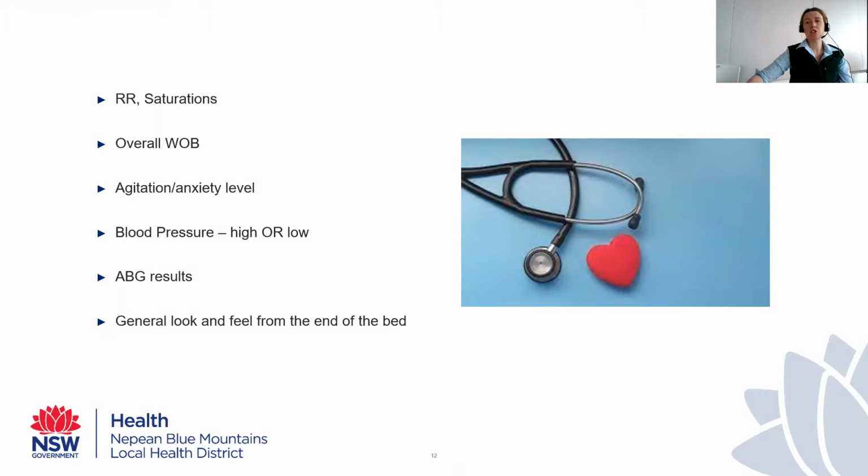But if nothing's changed, we need, again, to be consulting with our medical colleagues and thinking to ourselves, do they need more PEEP? Do we need to change them to BiPAP? Do they need to be referred for invasive ventilatory support or monitoring and observation in somewhere like an intensive care unit? But looking at overall work of breathing, our respiratory rate, saturations, any blood gas results that we might have, and always be mindful of our other hemodynamics, because that can be an indicator that a patient is worsening or that the settings that we're having them on are having a bigger hemodynamic effect.